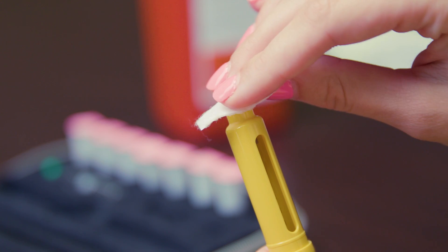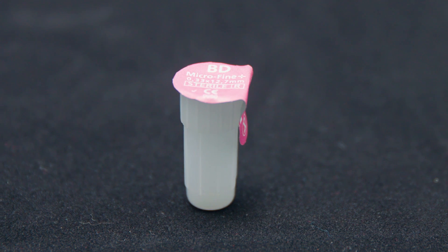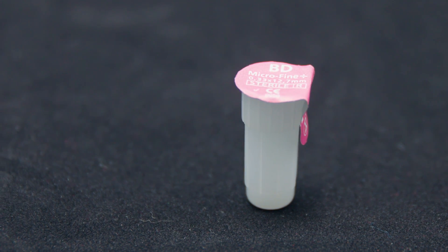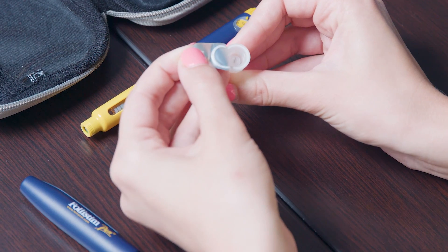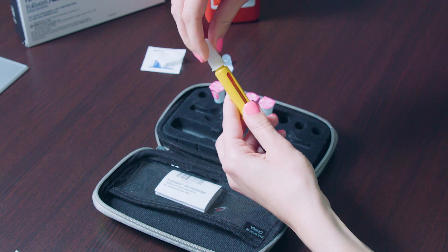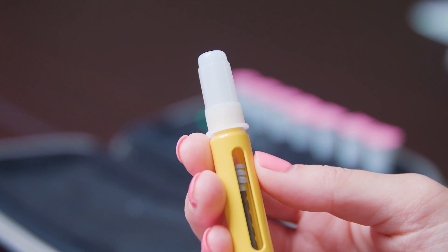Disinfect the tip of the yellow end with an alcohol swab. BD Micro Fine Needles must only be used once — make sure to use a clean needle for each injection. Remove the seal from the BD Micro Fine Needle and, while leaving it in the protective cap, twist it firmly into the yellow end of the pen. Do not let the sterile needle come into contact with anything, even yourself.